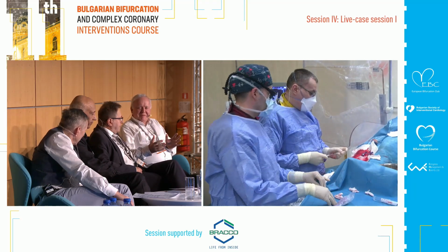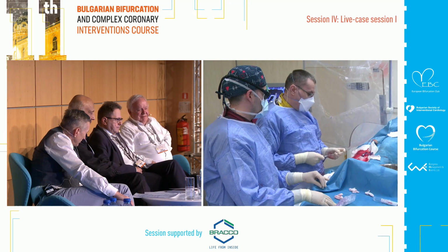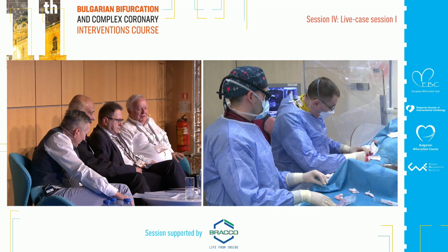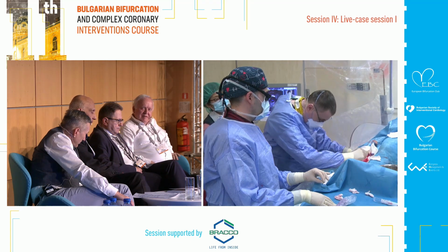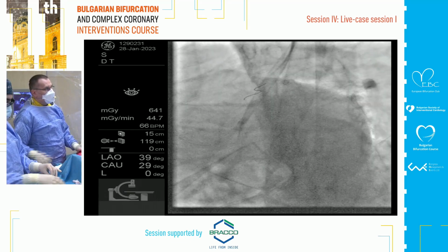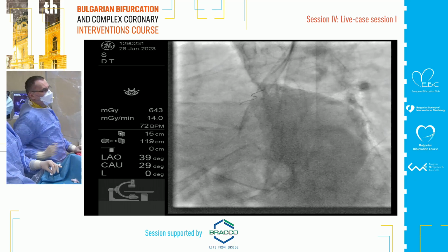If I push the carina, probably that will be a temporary closure of this circumflex. You're putting a wire down the circumflex now? If you stent at the ostium, you create a lesion, even if it's not always a tight lesion, creating a lesion in the circ.